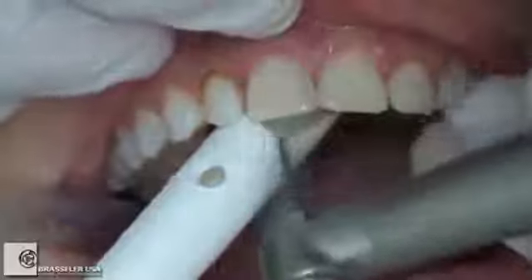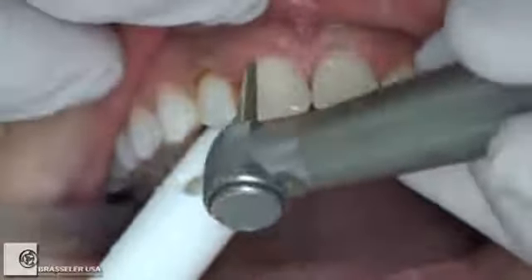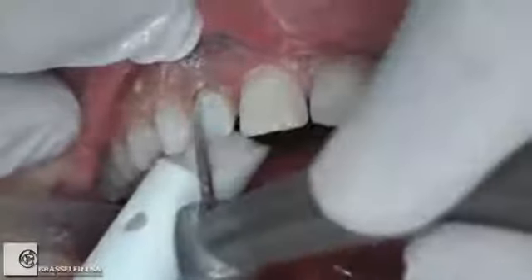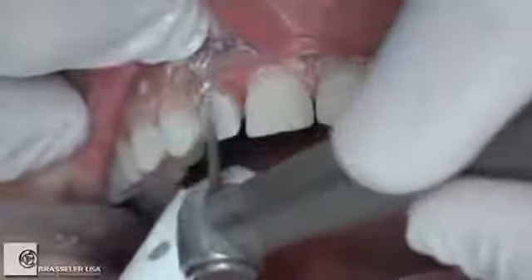I probably could have gone right ahead and did this even without the mock-up. But I wanted her to wear this for a while to get one aesthetic acceptance, but also functional aesthetic acceptance to the new length. All right, now we're going to go ahead and remove the rest of the material, bonding agent, a little composite that's still stuck to the tooth.